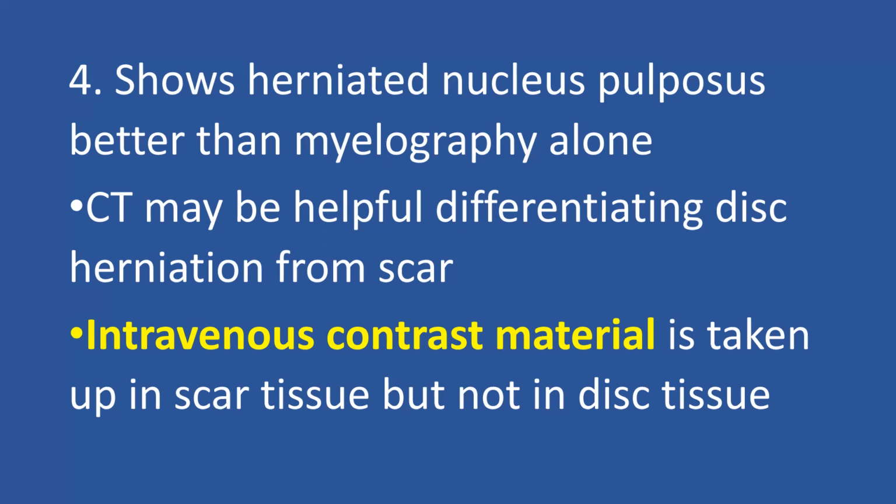I'll tell you, young fellows, if on the board they ask you, how can you distinguish between a disc and the scar? The scar has circulation. When you inject a contrast material, it will go through the scar. The disc is avascular. Many times following surgery on discs, we have recurrence of the pain. We want to know, is the recurrence from scar tissue or is it from a disc popping out in the leftover disc material within the space? So this will help us, but MRIs would help us more.